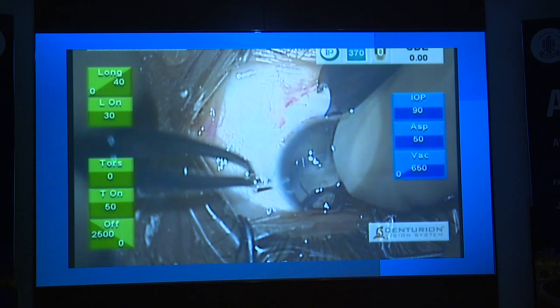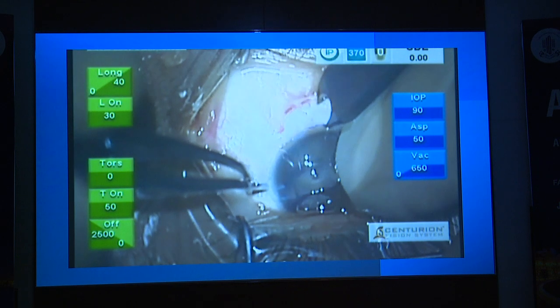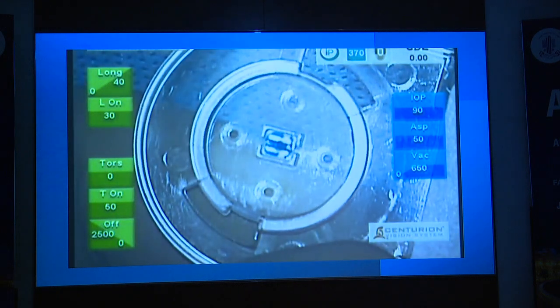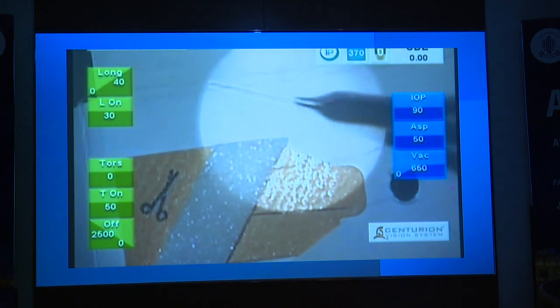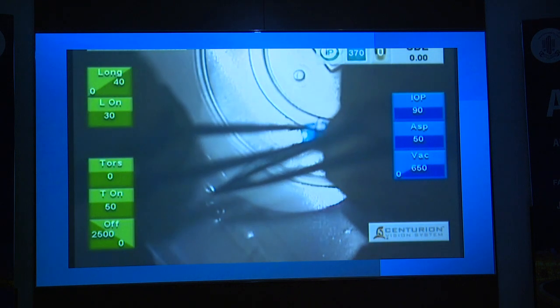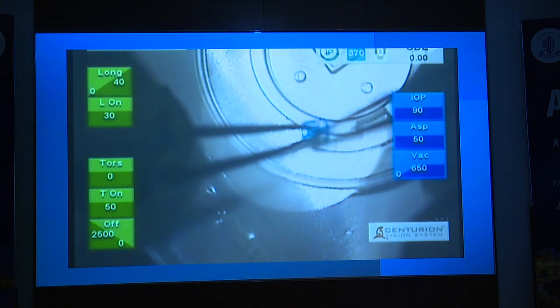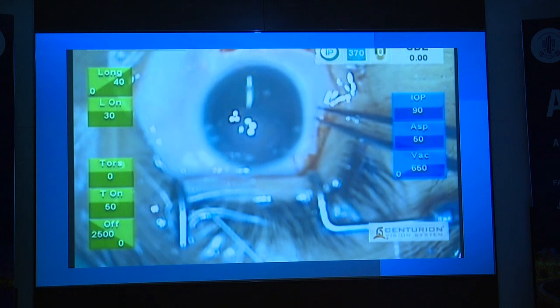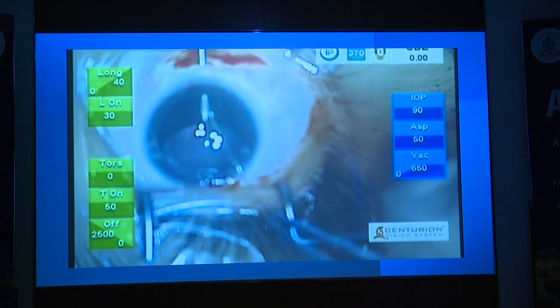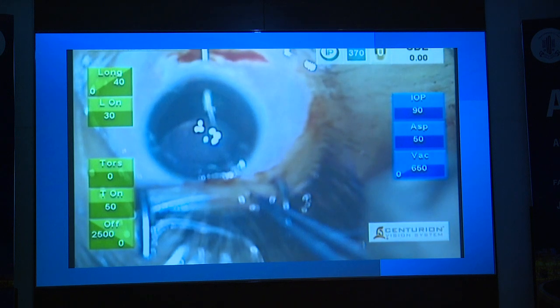So yes, we have a rhexis, but no, we don't have enough capsular rim in order to put capsule hooks. So you need a device like this called an ASIA anchor. This video was made 3 years back. And so this was ASIA anchor generation 1. There's a generation 2 now, which is 3-dimensional like a paper clip. So this is a 2-dimensional device. And once again, simple, just suture it to the Prolene and railroad the suture out of the eye.